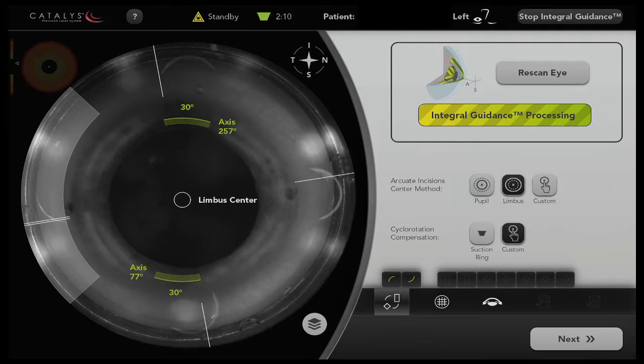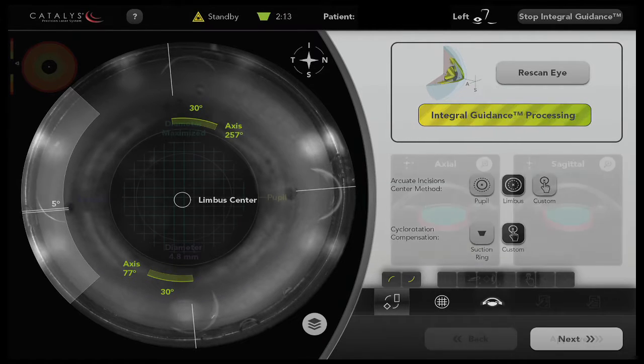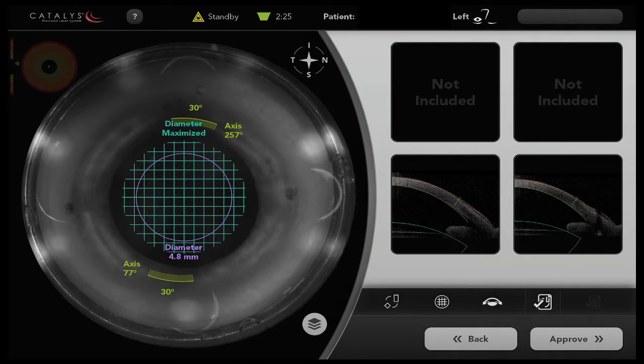In this case here, you can see that we're adjusting for torsional fit, and now we're also checking our incisions and plan.